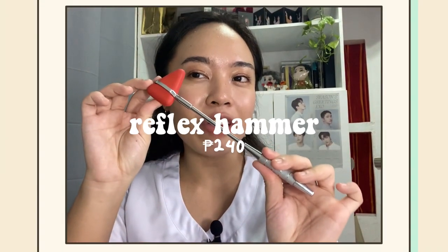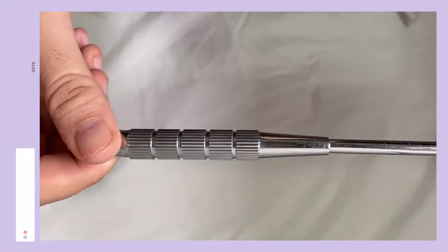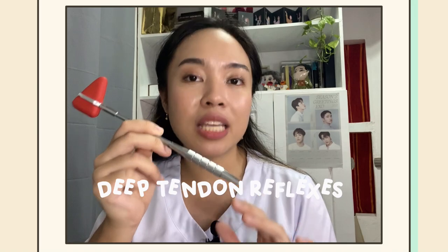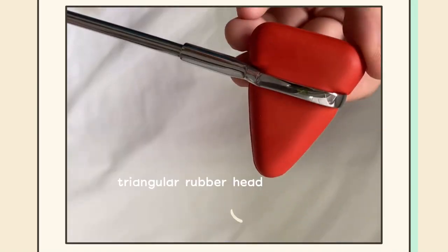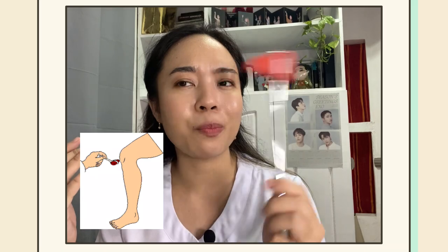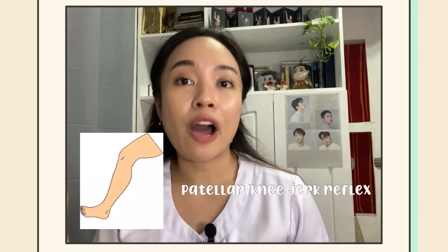First of all, we have a reflex hammer. I got the color red, one with a good quality handle. This one is usually used in neurology to test for deep tendon reflexes. To use it, you just have to point the triangular rubber head and strike any tendon — for example the knee tendon — in a single wrist stroke to elicit the reflex. After that, you have to note the reaction or reflex elicited.